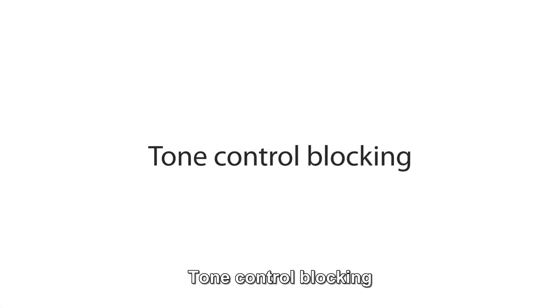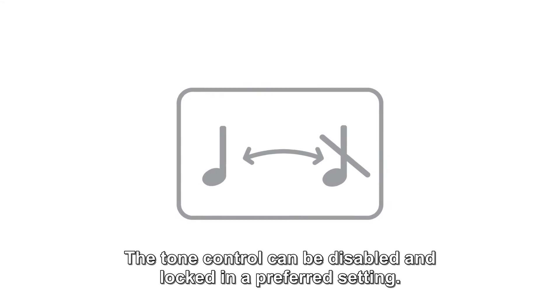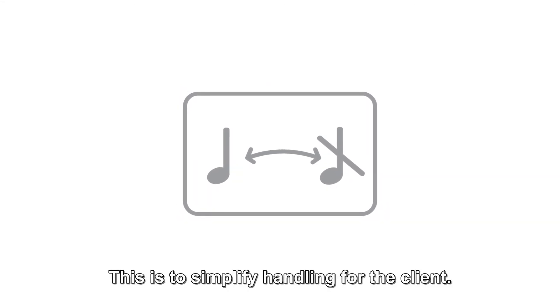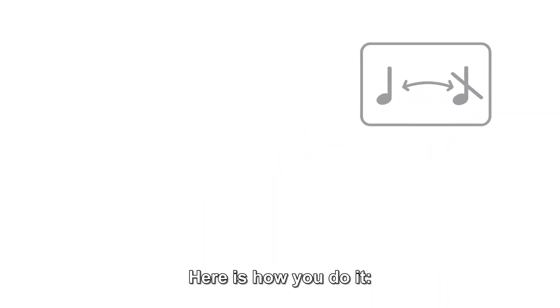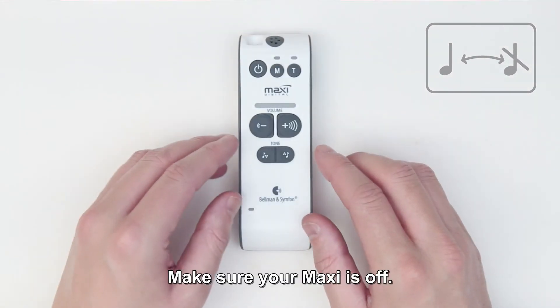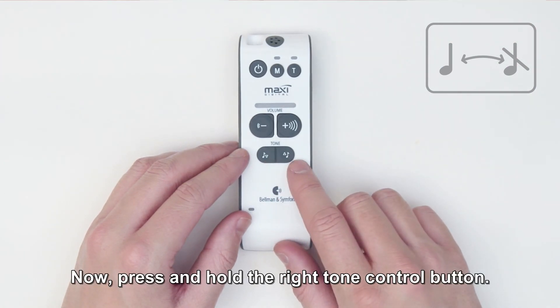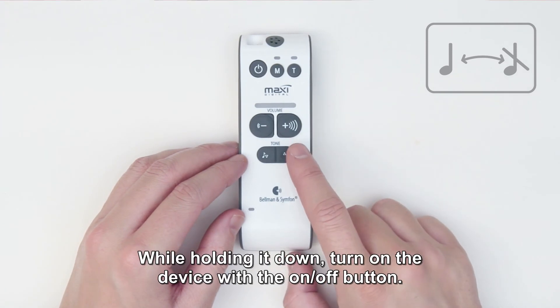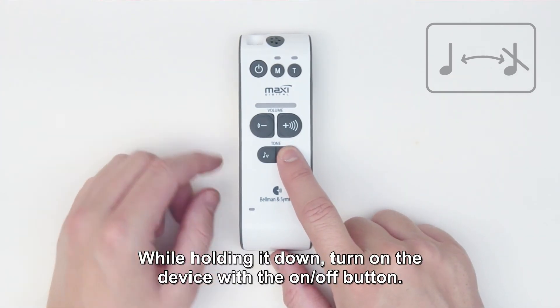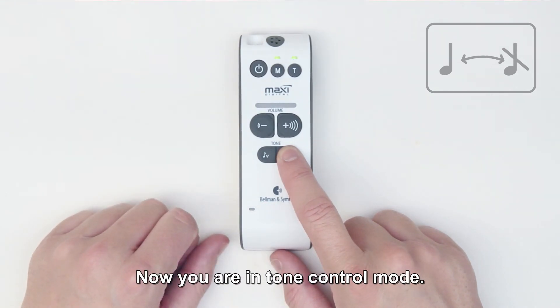Tone control blocking. The tone control can be disabled and locked in a preferred setting — this is to simplify handling for the client. Here is how you do it: make sure your Maxi is off. Now press and hold the right tone control button. While holding it down, turn on the device with the on-off button.